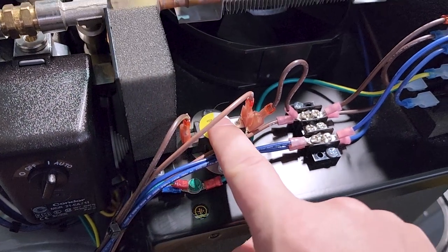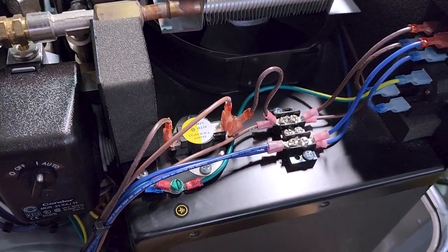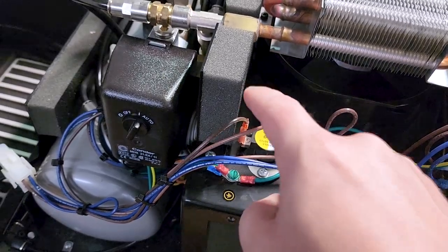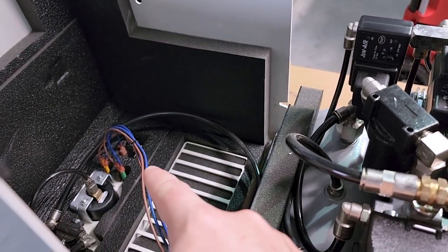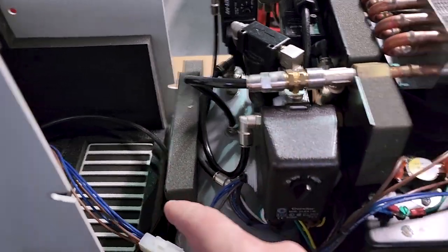You have a temperature switch right here. So this guy here is going to kill it if it gets too hot. And you can see it's all in series. See how it comes here, goes there, and goes there, right? Then it goes down to your control module and to your front control panel, right? So that would be your status indicators on the front.